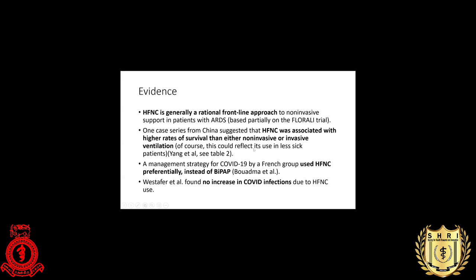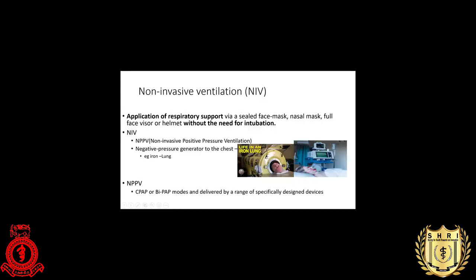One study done in China found a higher survival rate with high flow nasal cannula than with non-invasive and invasive ventilation. And some say HFNC is preferably better than BiPAP. All right, that's the end of high flow nasal cannulation, and then we'll move to non-invasive ventilation.